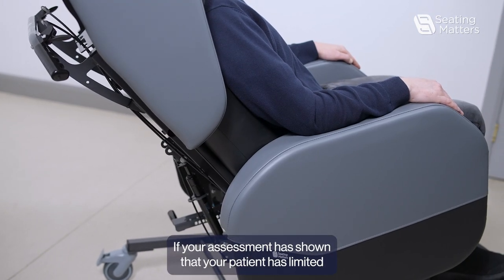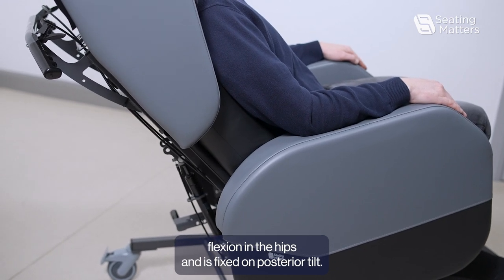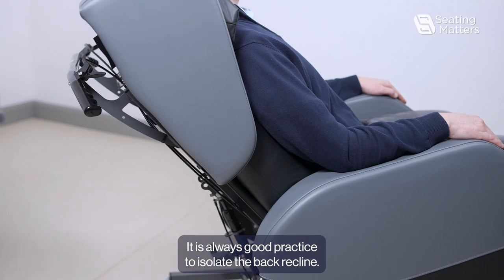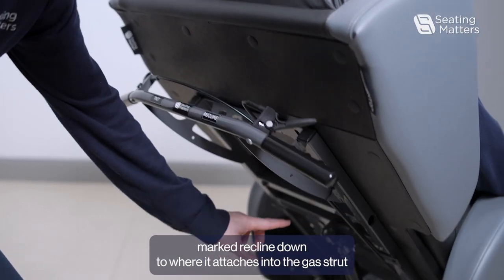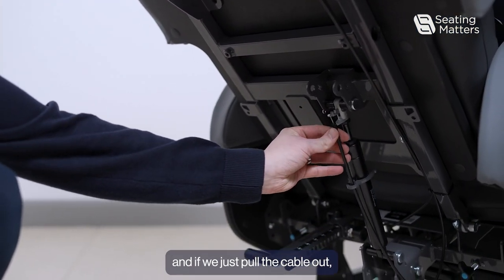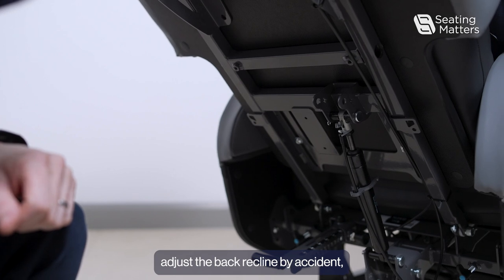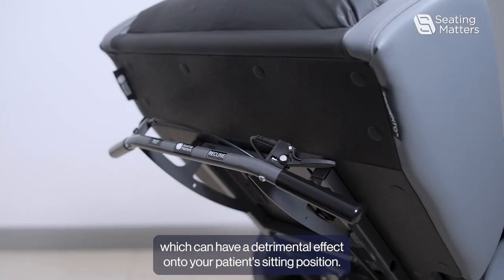If your assessment has shown that your patient has limited flexion in the hips and is fixed in posterior tilt, once you have set the back angle up in the chair and are happy with it, it is always good practice to isolate the back recline. So in the Sorrento, we can follow the lever marked recline down to where it attaches into the gas strut, and if we just pull the cable out, that is now the back recline isolated. That means that no one can adjust the back recline by accident, which can have a detrimental effect onto your patient's seating position.